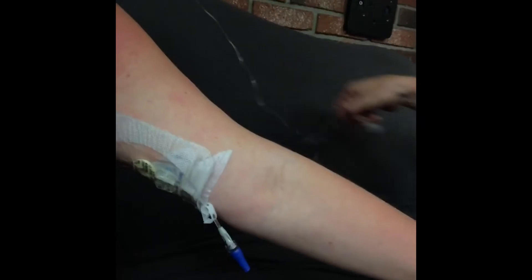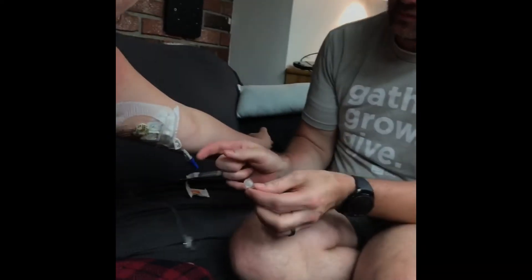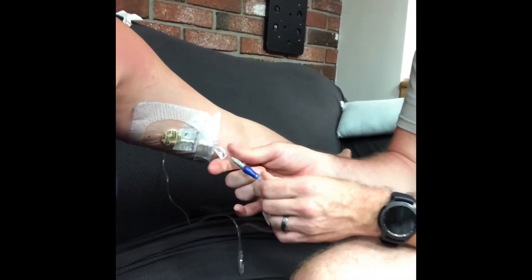Now 15 seconds have passed and he's going to hook up the antibiotics, which come in a very long tube. We unclip the bulb, take the cap off, and then hook it up. That completes the first two steps of SASH — Saline and Antibiotics — and now we have to wait about an hour.